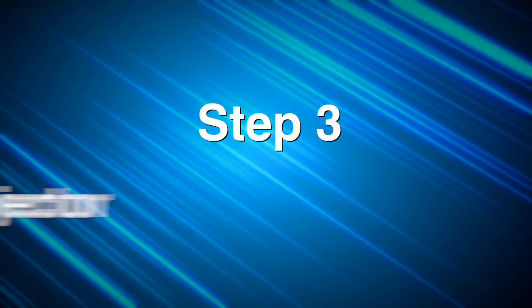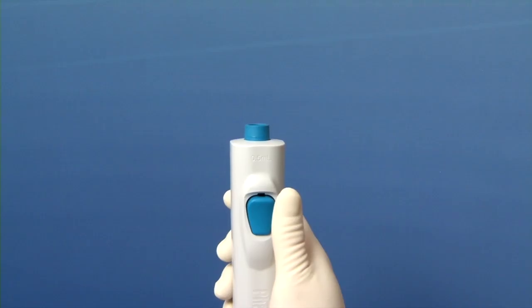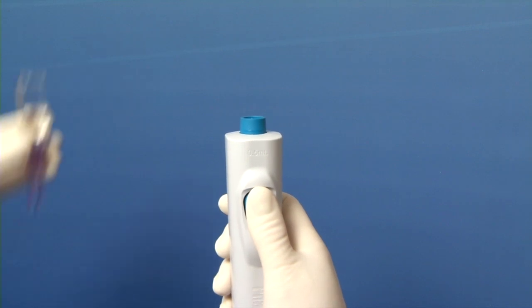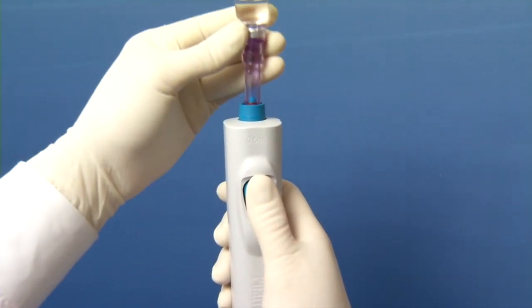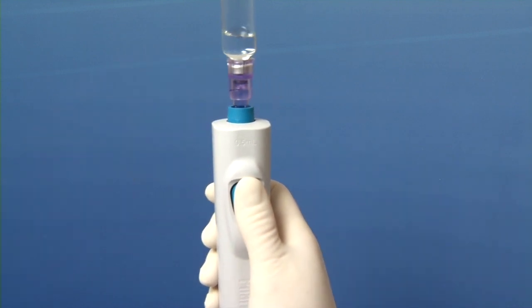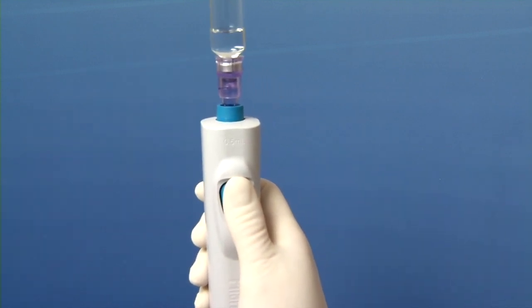Step 3. Load the injector. Pick up the charged injector and with your thumb depressing the multifunction button, orient the injector with the blue ring pointing upward. Insert the base of the filled syringe into the injector until you hear a click, locking it into place. Any overfill in the syringe is purged back into the vial during this step.